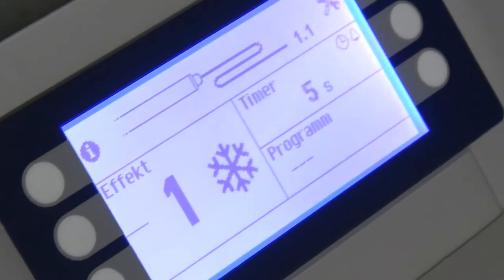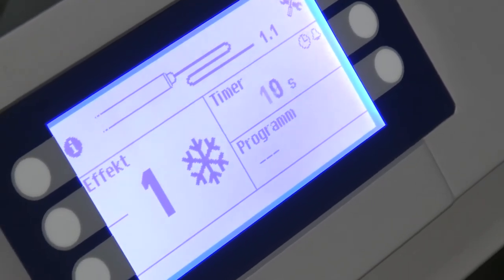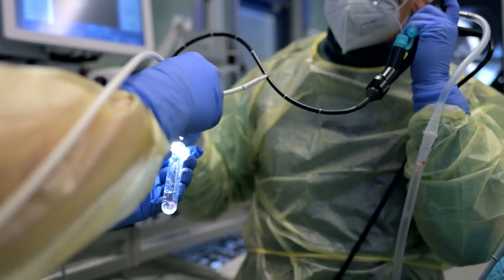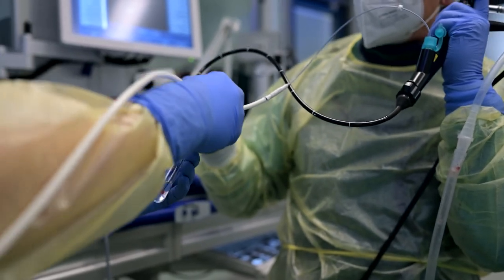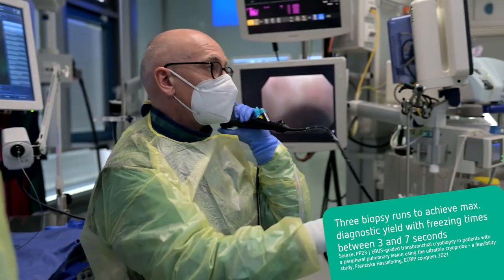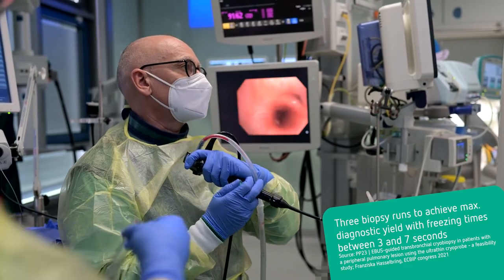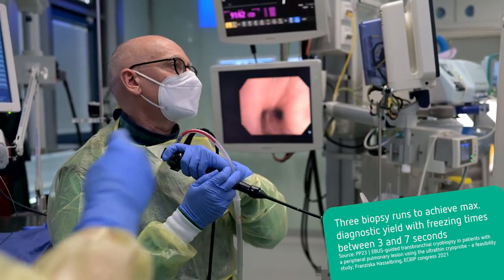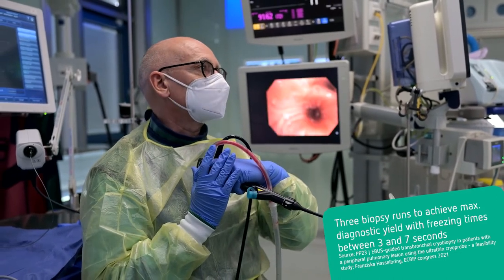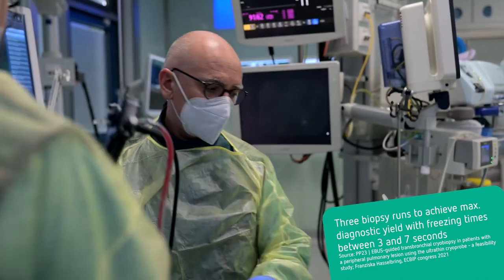Depending on the clinical setting, technique, and disease state, lower freezing times for cryobiopsy have also been found to enable harvesting of samples adequate for diagnosis, while lowering the fundamental risk of bleeding. The bronchoscope is reinserted for inspection and bleeding control. In the event of mild bleeding, suction is sufficient to evacuate blood from the airway. Wedging technique and injection of ice-cold saline are able to control moderate bleeding. Only severe bleeding causing hemodynamic instability would require interventions exceeding the possibilities of bronchoscopic control.